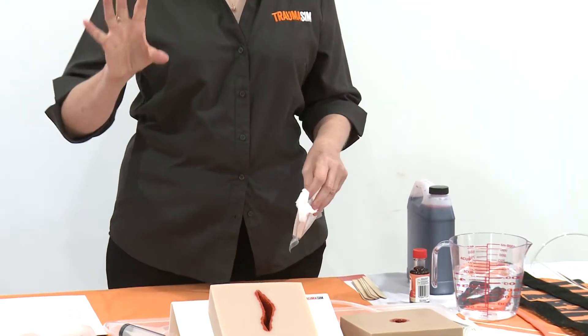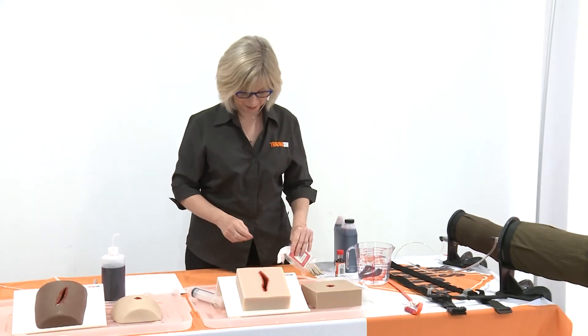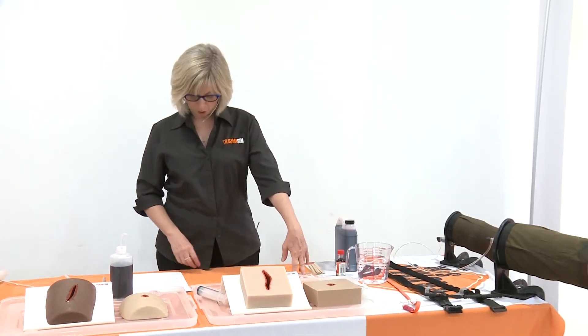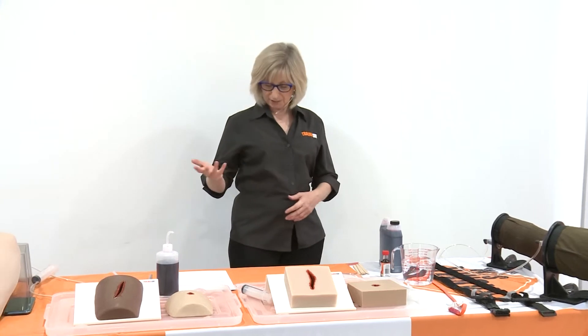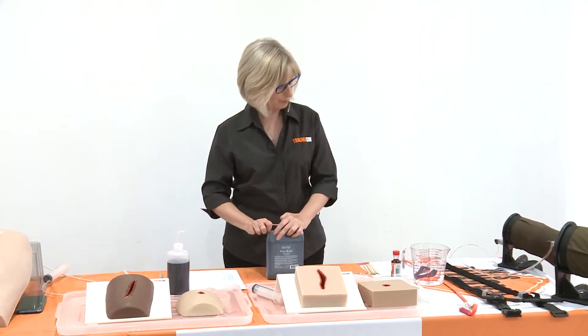You might want to show them what the real stuff looks like and then say, but for today we're going to use the training aid. Some scissors to cut that off so you're not wasting too much, gloves if you need it, and then we want some blood — the key component to what we're doing.